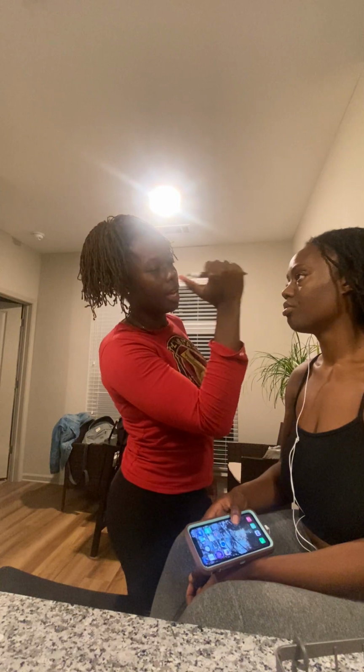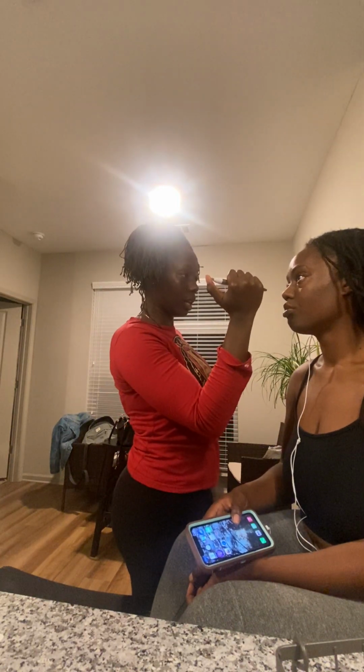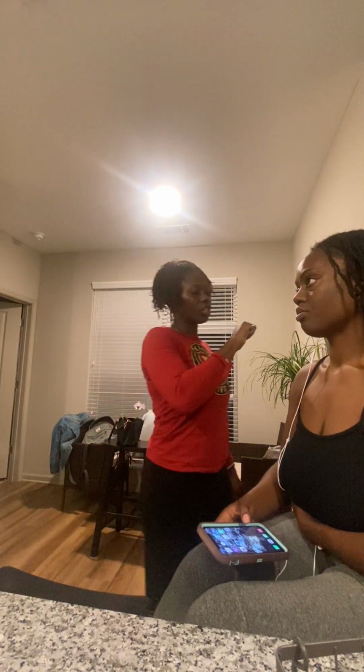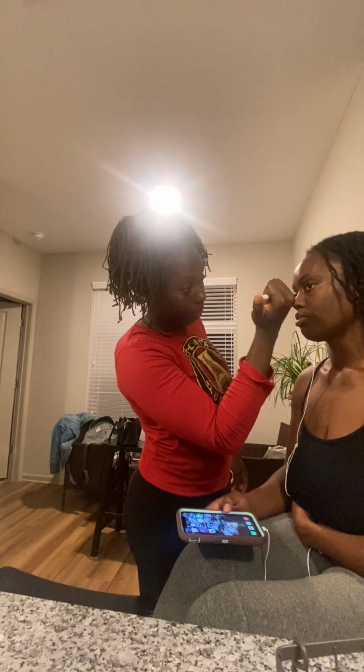So I'm gonna take my pen light here. I'm just gonna shine them in one light, and I'm looking for consensual light reflex in the opposite eye. So I'm starting here. I see that direct light reflex and then consensual. Then looking at the opposite, I see the direct reflex and then consensual constriction in that opposite eye. Beautiful. I'm just gonna shine my light on the side of your eye, checking out your cornea and your iris.